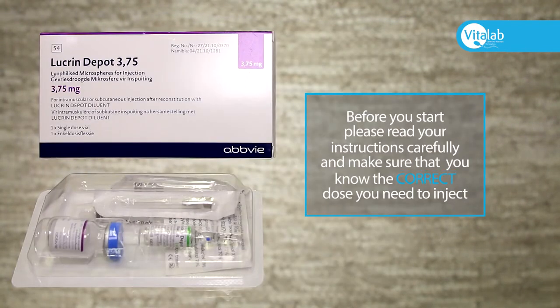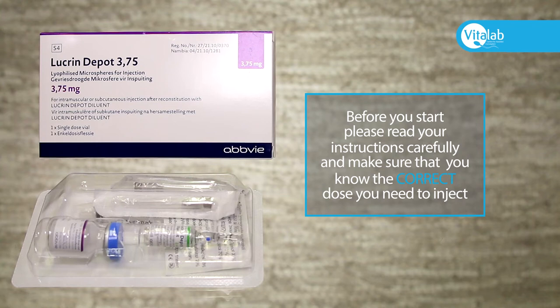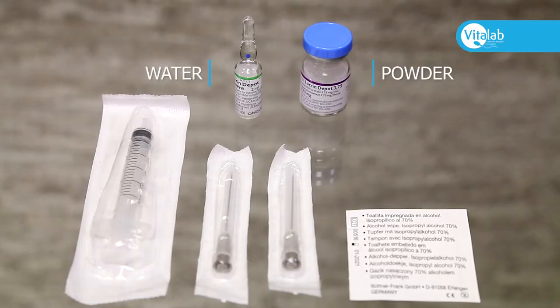Before you start, please read your instructions carefully and make sure that you know the correct dose that you need to inject. Open the packaging — you will see a vial with powder, an ampoule with water, one syringe, and two needles.